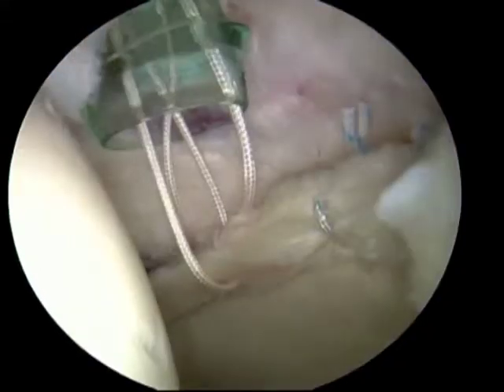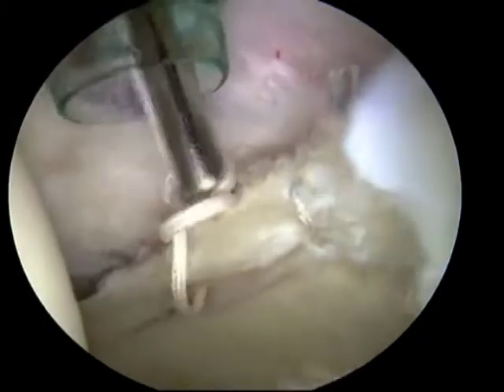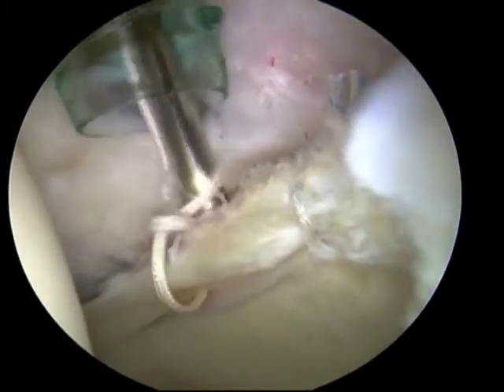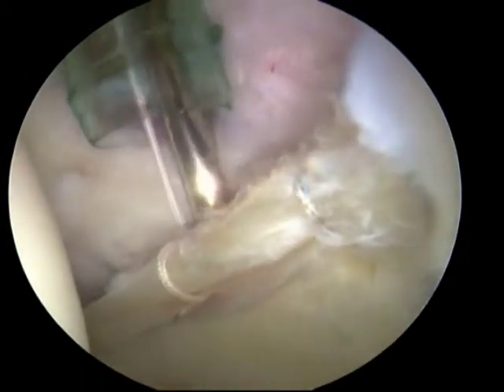Arthroscopic knots are then tied and multiple throws are demonstrated in this video to ensure knot security. The knot itself is buried away from the articular surface to prevent abnormal wear on the articular surfaces.